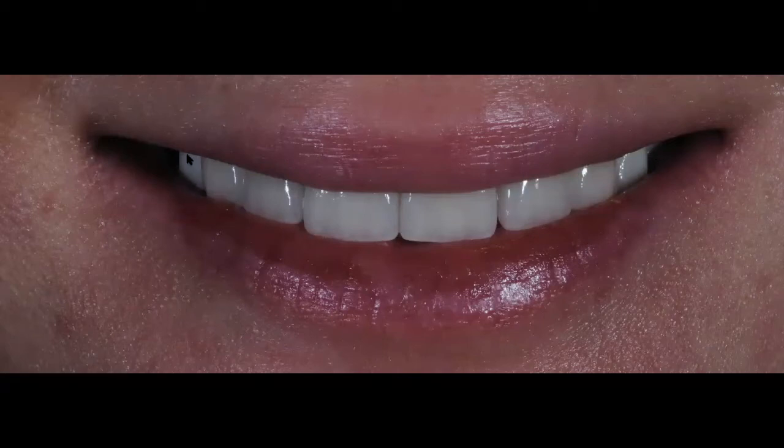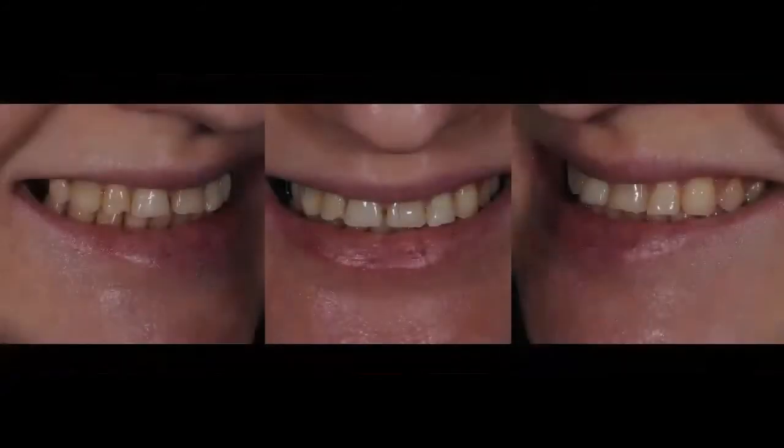You can see the white opaque type of shade that we have on this premolar, because this is now a stronger restoration, but at the same time a more opaque restoration that I chose for posterior teeth in this particular patient. And I gave her more translucent zirconia on my anterior teeth. Now, I think the result is still a really good and beautiful result. But with the combination, you have to be aware that you're going to see these differences.